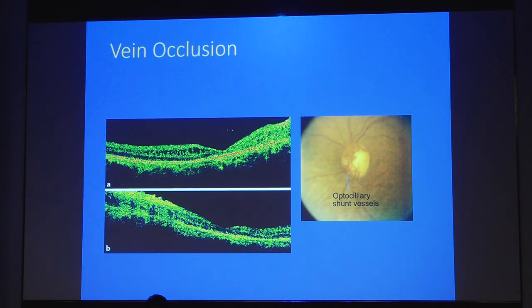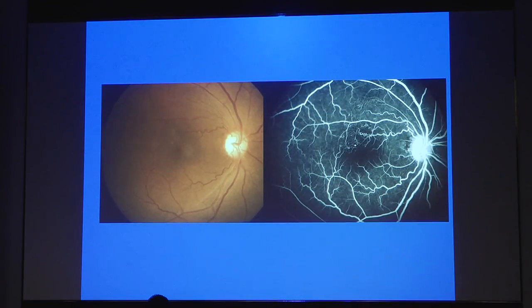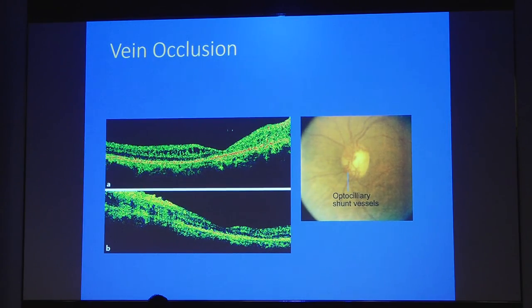Some patients may have a vein occlusion where there will be thinning of the retina, and it may be missed because all the features of hemorrhage and so on would have decreased, and you may not be able to identify this condition. So preoperative OCT becomes most important. It's ideal for all patients undergoing surgery to have a preoperative OCT so that any leftover or missed pathology can be found out.